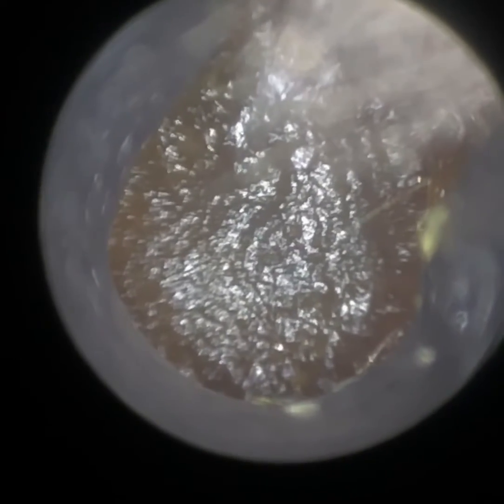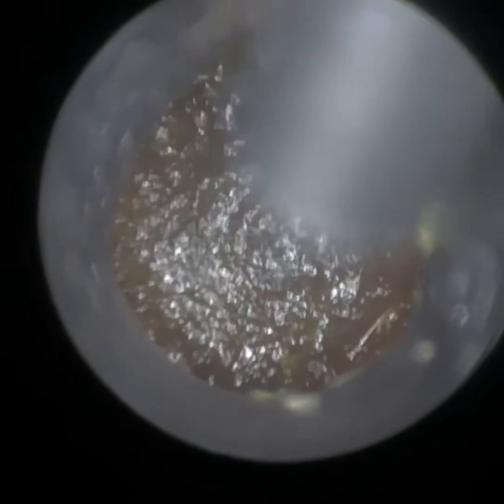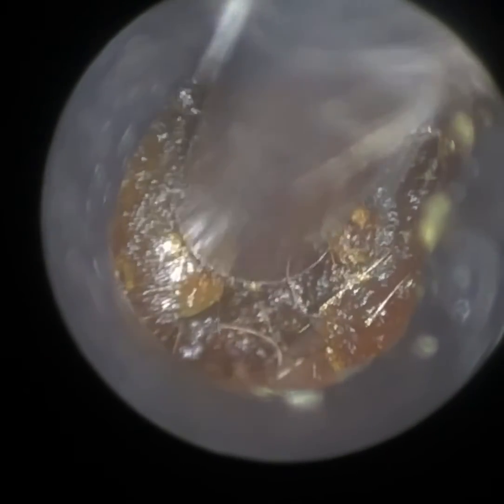So this is their left ear. This was also extremely blocked, as you can see, but the patient didn't feel it was as bad as their right side. I'm just dilating the ear canal. Although this was impacted, I don't think it was directly on the eardrum — it was probably a few millimeters away.